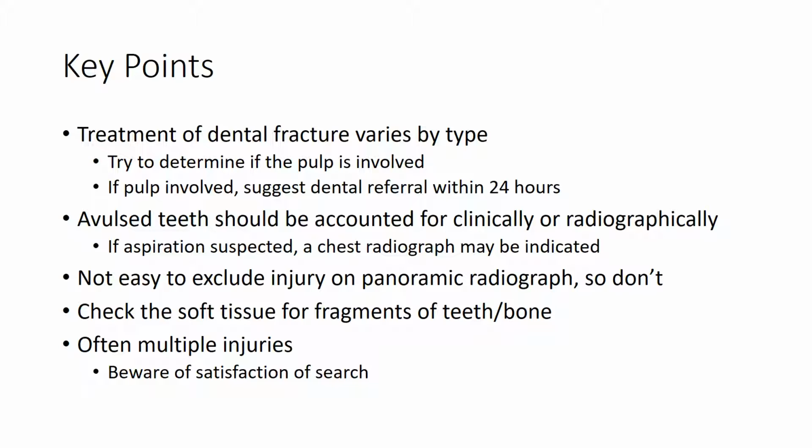It's really important to check the soft tissues for fragments of teeth or bone. This is something that the clinician may not see, and any remaining tooth fragment can be a nidus for infection and poor wound healing later on. And then with dental injuries, there are often multiple injuries, so be aware of satisfaction of search.